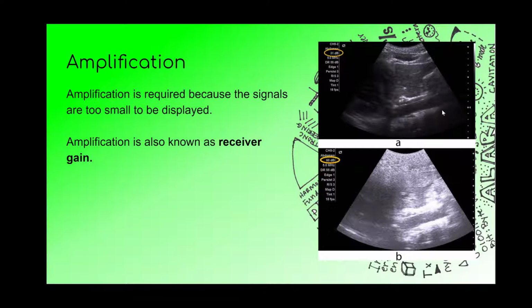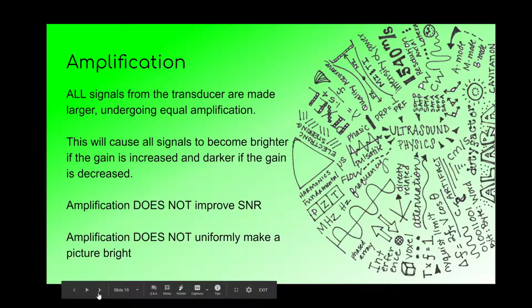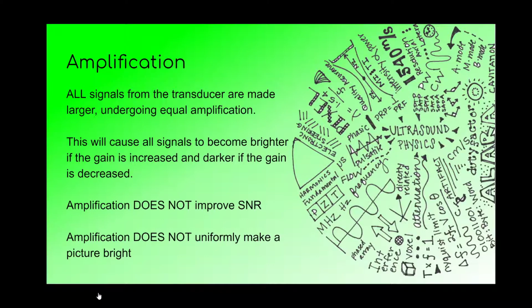When we increase the receiver gain, we take all the echoes and make them brighter. There's no discernment between which echoes should stay dark. They all get the same amplification. No matter how you change the amplification, whether you increase or decrease the gain, all the signals undergo equal amplification. It is important to note that amplification does not improve the signal to noise ratio, because it also amplifies the noise. So it amplifies the signal and the noise. Amplification also does not uniformly make a picture bright. If you already have a dark near field and a bright far field, your far field is just going to get brighter along with your near field getting brighter. So amplification treats all the signals the same.